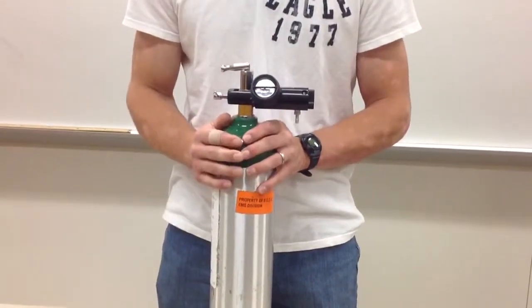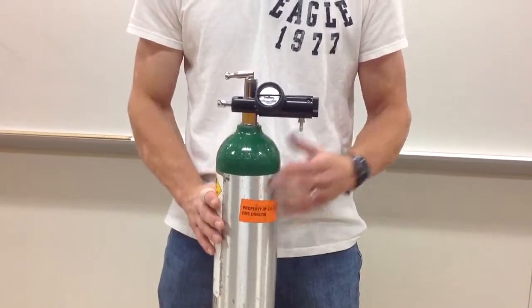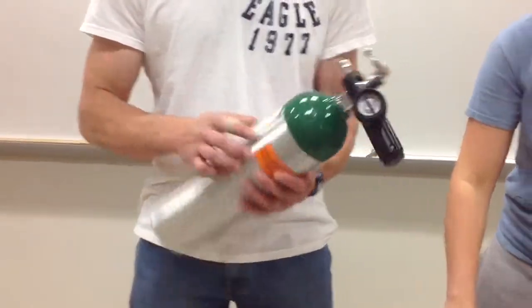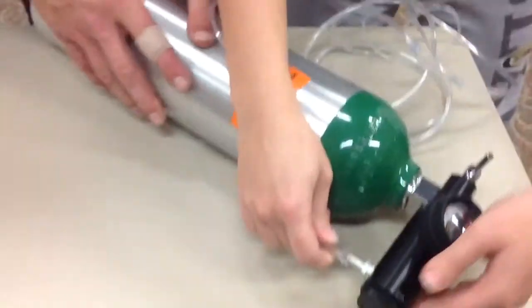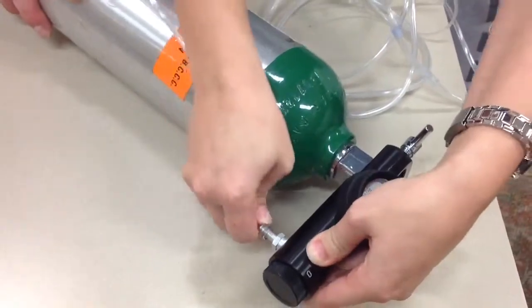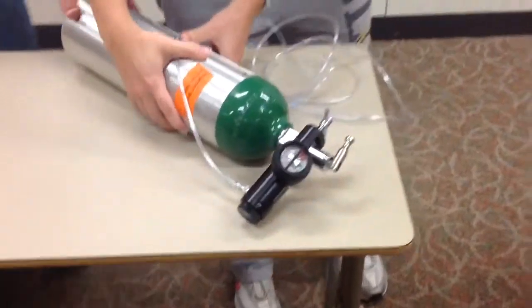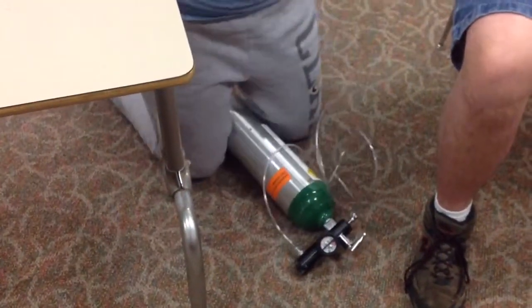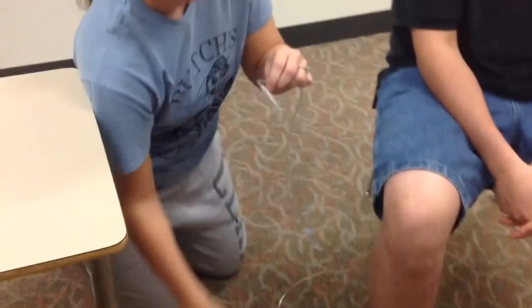Once secure, you're now ready to administer your oxygen via the nasal cannula. To do so, you're going to attach the tubing to the regulator. Before attaching the tubing, if you are working by yourself, you can set the oxygen cylinder on the ground next to your patient. For sanitary purposes, do not let your cannula sit on the ground.